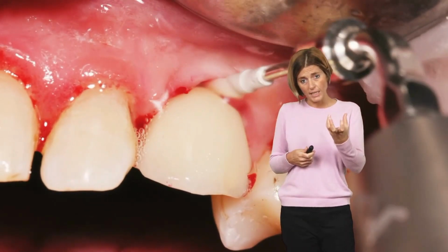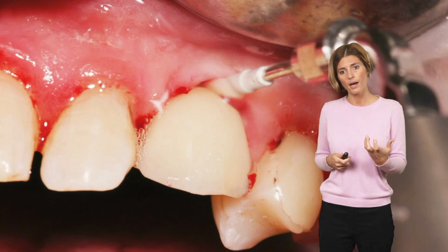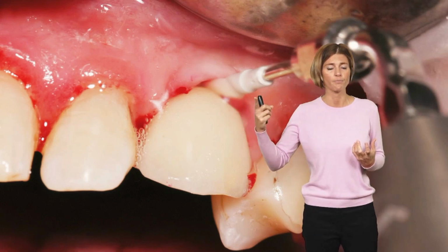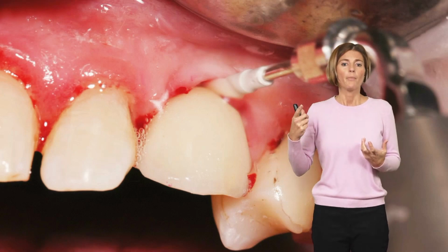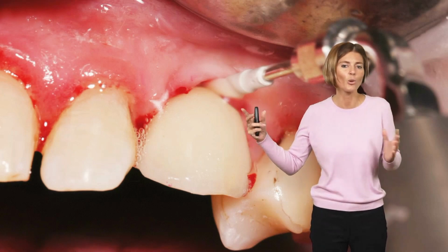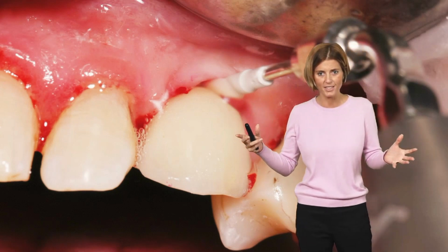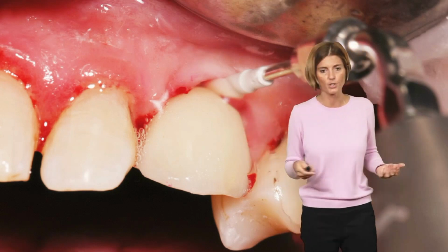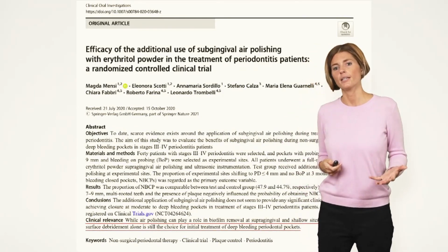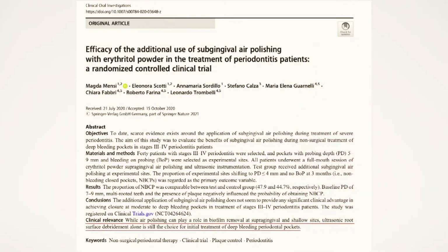Usually the PI tip is big, as you can see here, it's a big diameter, but if you have a very inflamed transmucosal tunnel, there is no problem in introducing the PI tip. So in this situation, it's very useful. And here you have again the evidence.